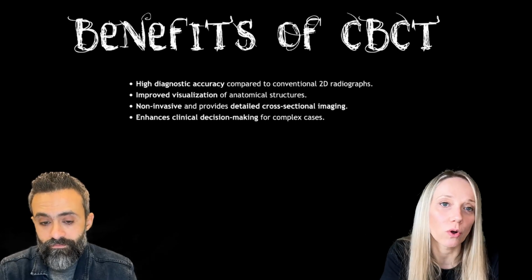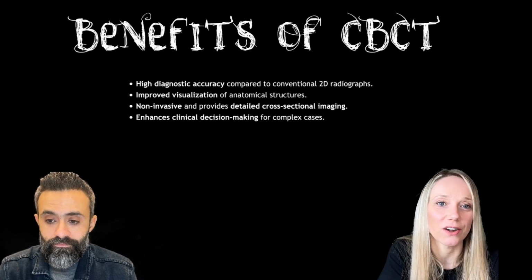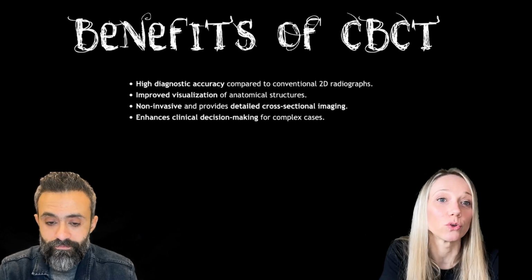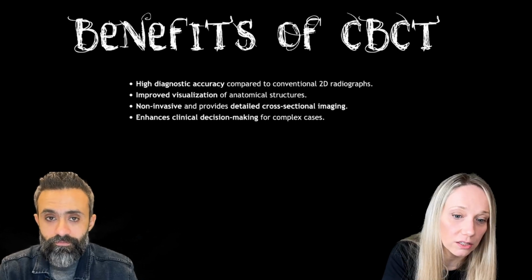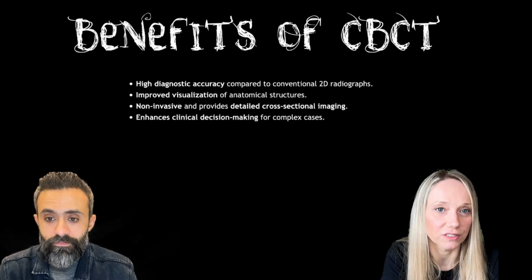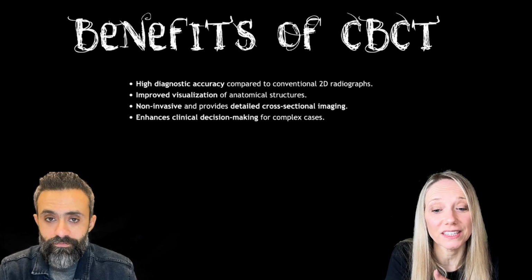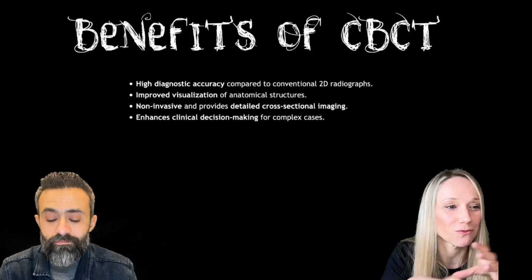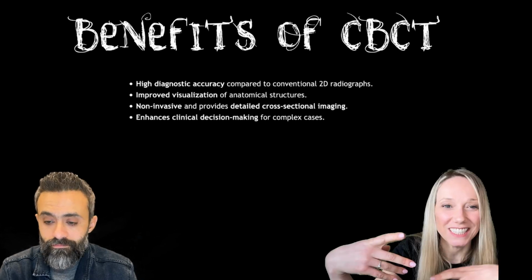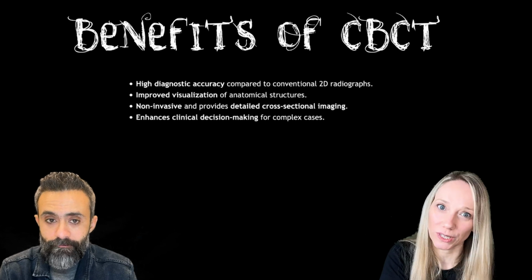And nowadays, with modern armamentarium, we can have a very good quality image without irradiating the patient a lot. And so, of course, this can be helpful in our clinic, and it gives us detailed cross-sectional images. We can watch the patient from every aspect, axial, sagittal, etc. And so we can have all the information that we need.